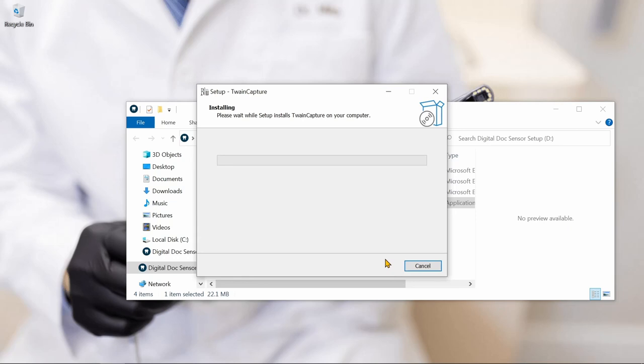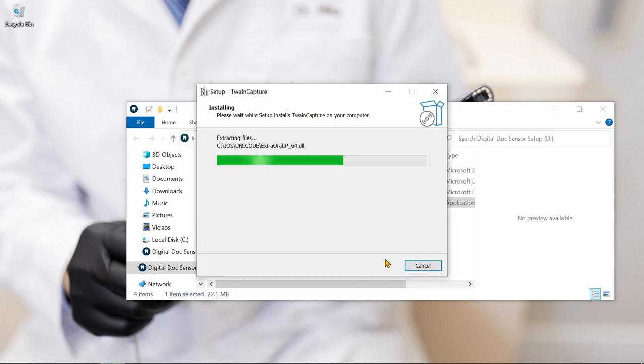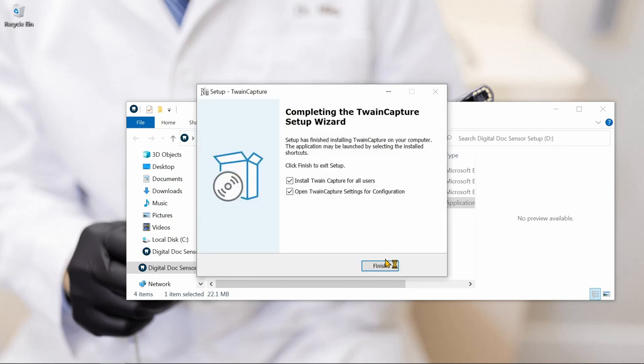Each individual sensor has its own specific installer, which contains the calibration files needed to generate quality radiographic images.